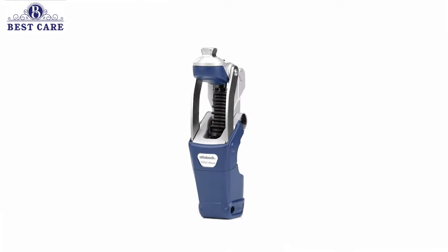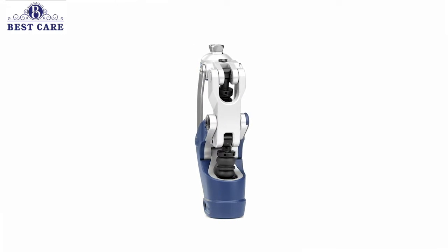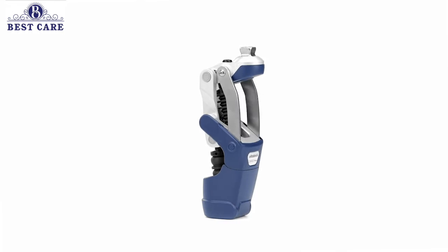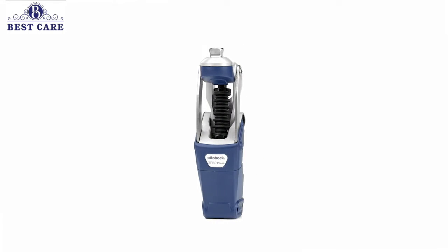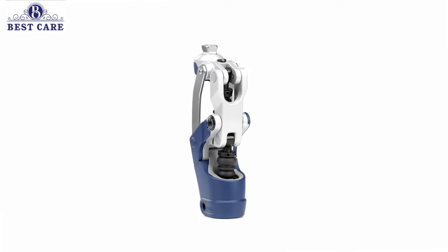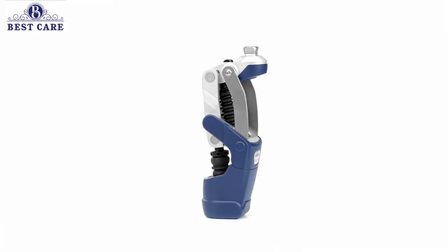The Fion 3R62 is a polycentric knee with stance phase flexion control and an innovative mechanical swing phase mechanism. Its functions make it especially well suited for low mobility users. Thanks to the optional integrated lock, which can be activated or deactivated by the prosthetist, Fion provides targeted support for the post-amputation therapy process.